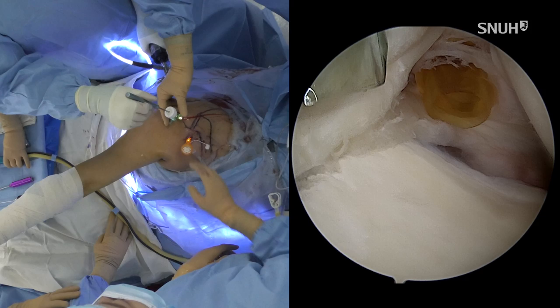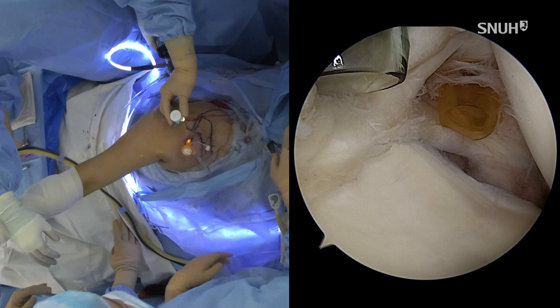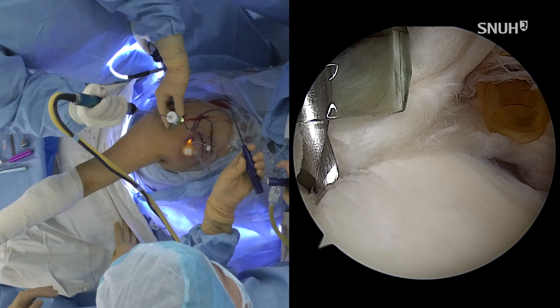I will start the posterior part first, okay? At the beginning, I like to make a posterior portal, for the posterior SLAP repair first, around here. So make a mark here, not too loose.